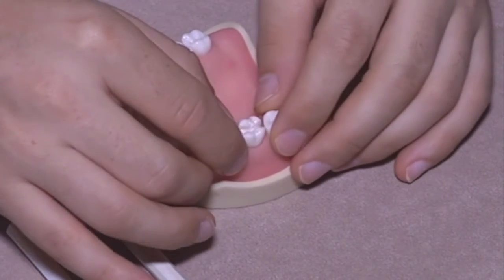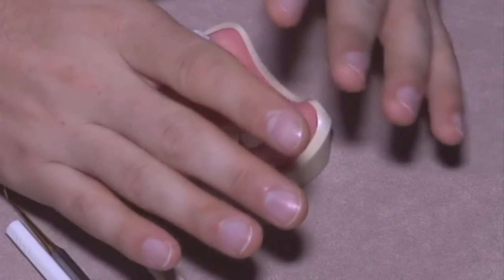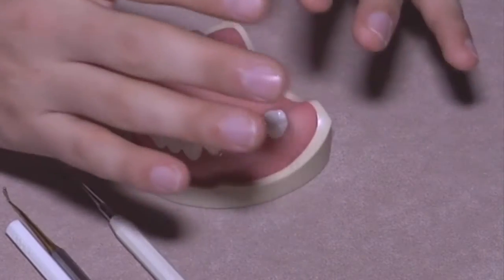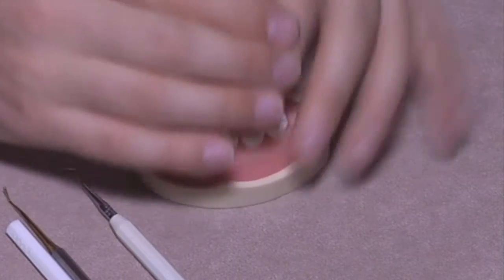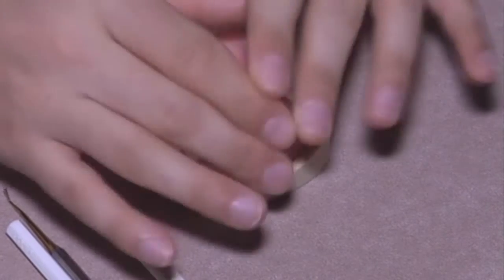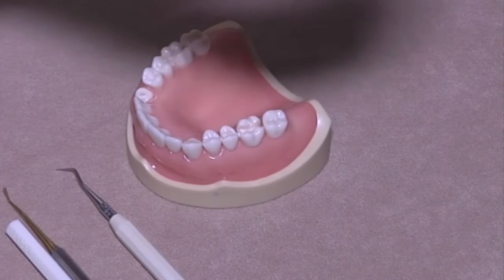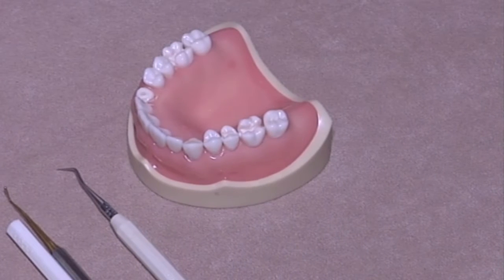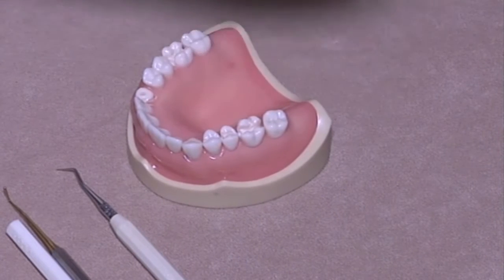About the composites, in the posterior teeth, as I told you before, aesthetics is not that much important as in anterior teeth. Aesthetics doesn't mean shape, so I pay a lot of attention in shaping and modeling the composite in order to simulate everything of a sound, real, normal tooth.